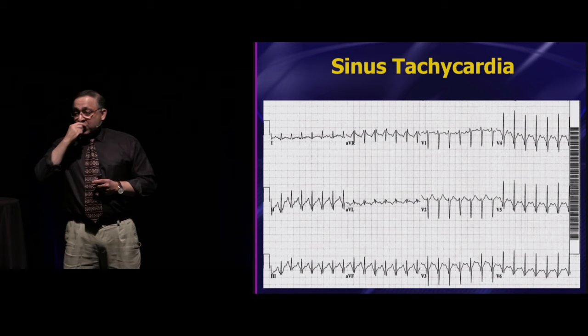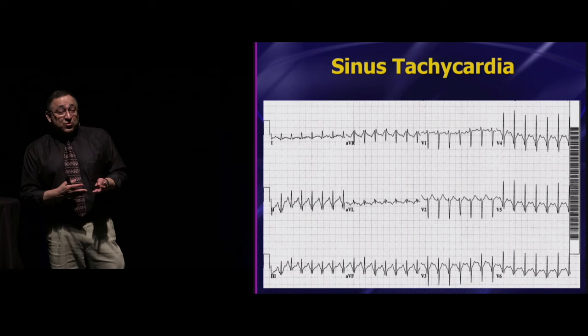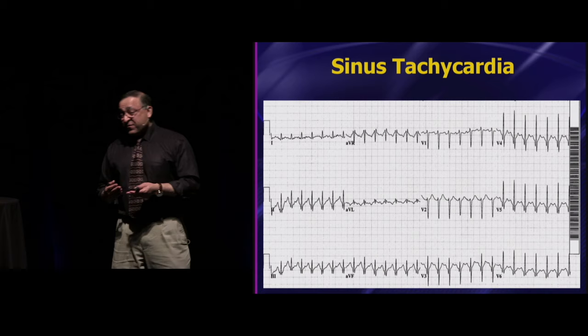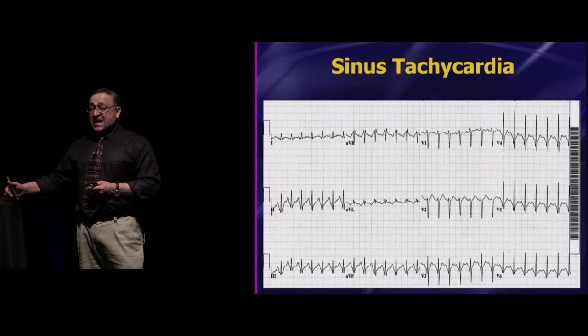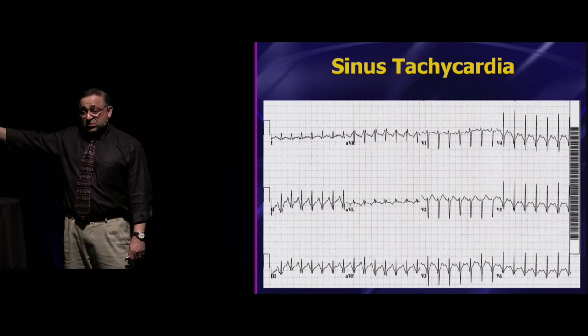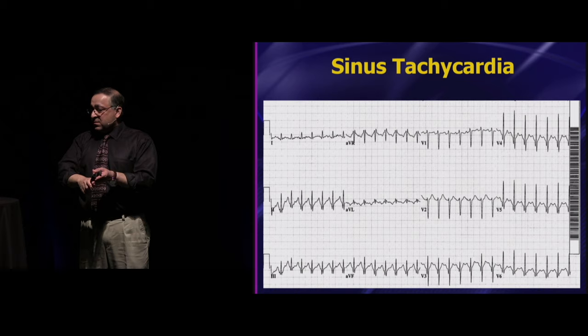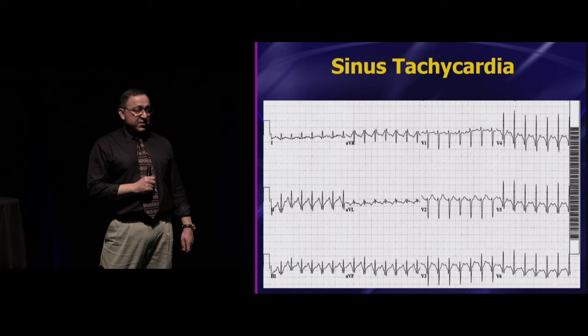So if you have a 20-year-old, a 20-year-old could probably mount a sinus tach of almost 200. If you have a 2-year-old, that's really tough because with 2-year-olds, you've seen our newborns, they can have a sinus tachycardia of 220. It becomes very, very difficult. An 80-year-old is only going to be able to mount a sinus tach of about 140. So let's say you're looking at this, the heart rate here is 160. If I told you this was an 80-year-old with a heart rate of 160, you already know sinus tach is off the table, which means it's only one of two possibilities, a flutter or SVT. So 220 minus your age can sometimes be helpful in terms of narrowing your diagnosis.